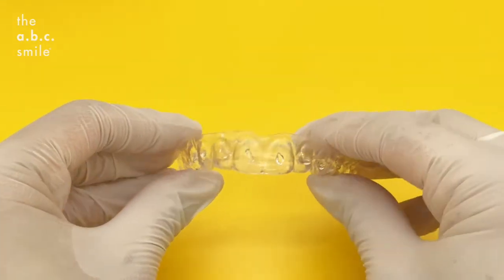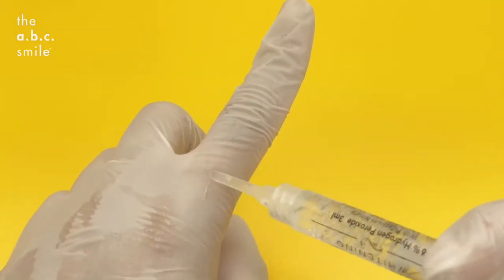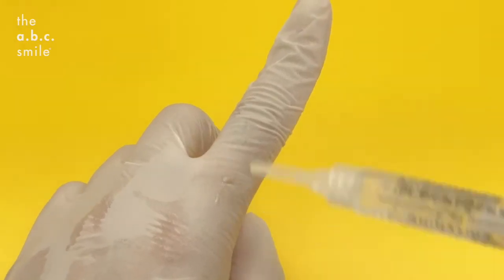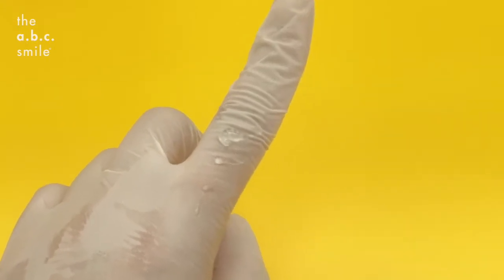As these trays are custom made, the amount of gel you need really is as small as you see here. To illustrate more clearly: this is too little, this is just right, and this is too much. Placing too much of the whitening gel will simply leak out and irritate your gums.